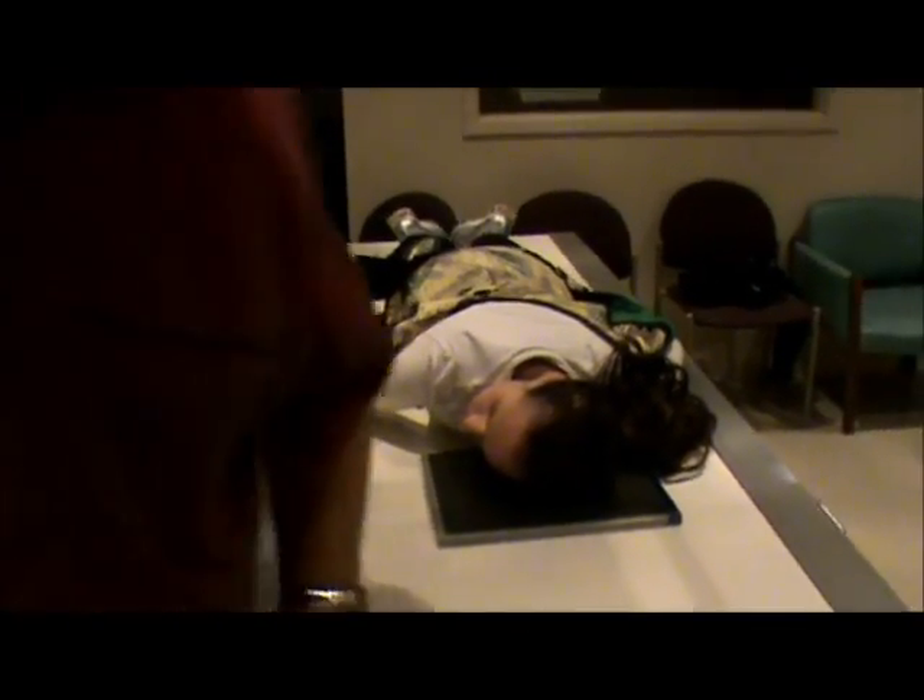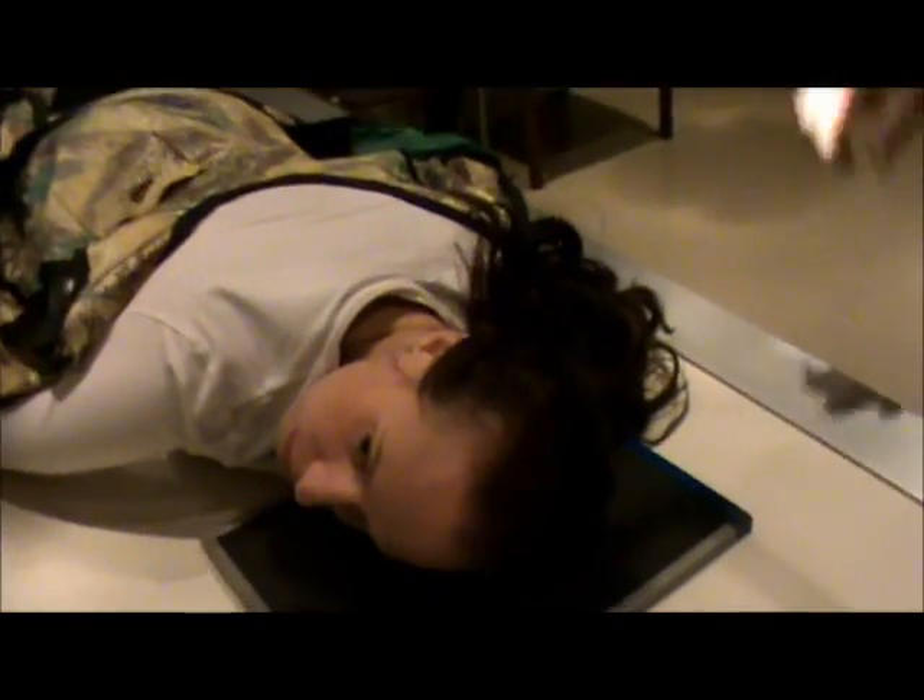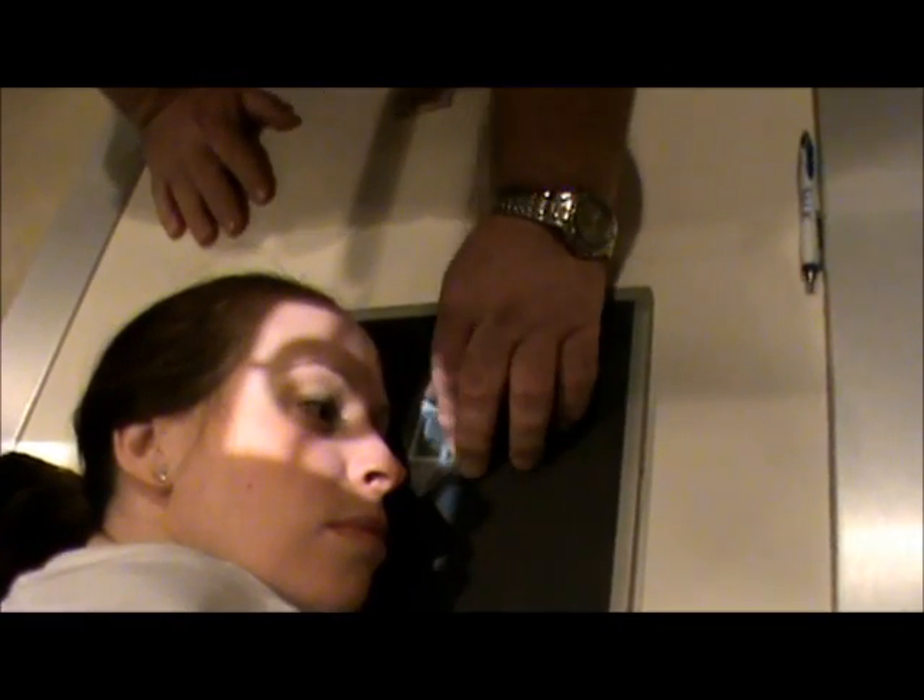Once I've done that, we can recenter. I'm going to center again at the inner canthus of the eye. I'll have the patient raise their head slightly so I can move and center the film. We're going to use our left marker as we're doing our left lateral. Technique remains the same: 44 kV at 4 mAs. These are our nasal bone x-rays.